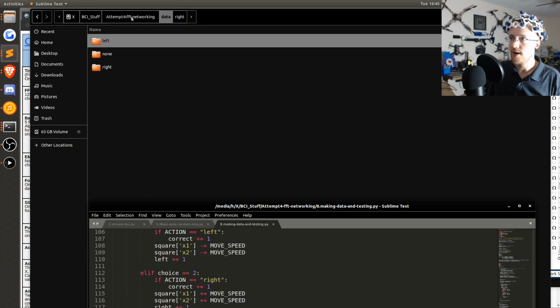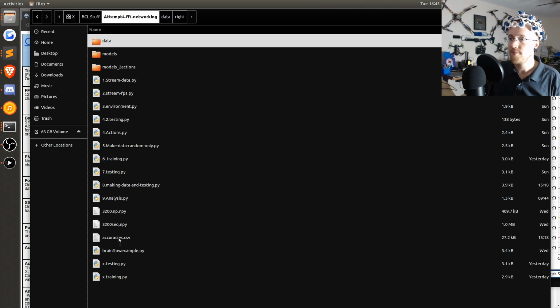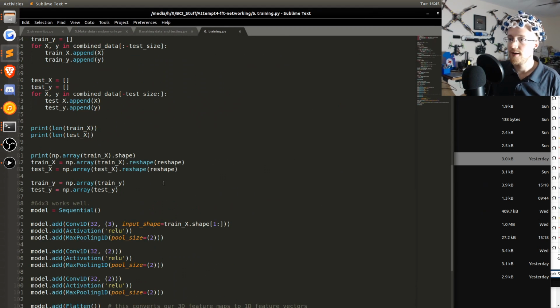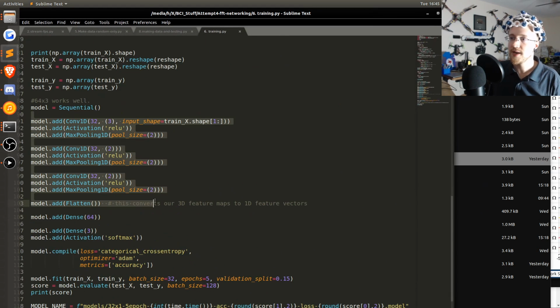Right now the convnet is, I think, 32 by 3, but I've been trying a ton of different ones, and I can pull that up as well. Yeah, so right now we're doing a 32 by 3, and that's really it. And that seems to be actually working, which is really surprising. I didn't think I was going to get results as quickly as I did, but once I got the FFT data, I was able to start training something. That said, I think left and right should be pretty simple to detect just based on channels alone. So anyway, we'll see. Lots more to go.